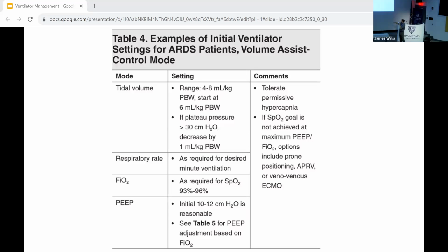And then keep an FiO2. Look at your pulse ox. What's your goal? Is it 88 to 92 or 92 to 96? You don't need 100%, but decide what your goal is, and then you could adjust your PEEP based off of that, and then go down on your FiO2 as tolerated, just to get things started for your hypoxemic respiratory failure patient you just intubated.